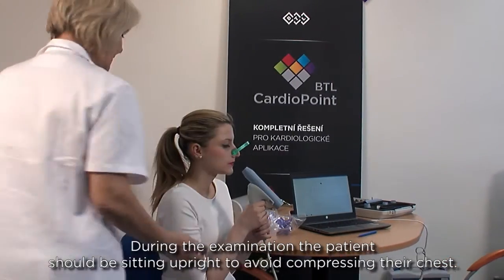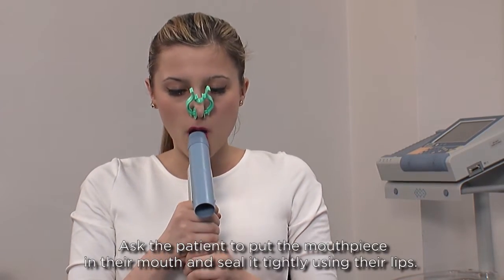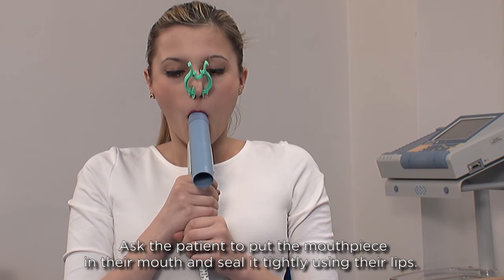During the examination, the patient should be sitting upright to avoid compressing their chest. Ask the patient to put the mouthpiece in their mouth and seal it tightly using their lips.